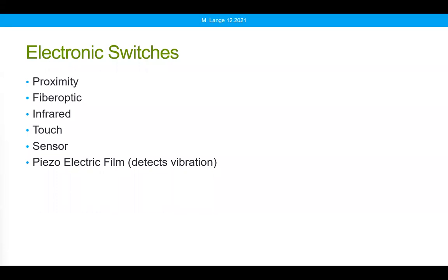Or like you said, you could take advantage of some of those lending libraries. One thing I've certainly done over the years is if somebody is no longer using a certain type of switch and they're willing to donate it to our clinic, we will take it. And we use those switches for loaner switches, for evaluation switches all the time. But yes, you can often get loans. It depends on the manufacturer.